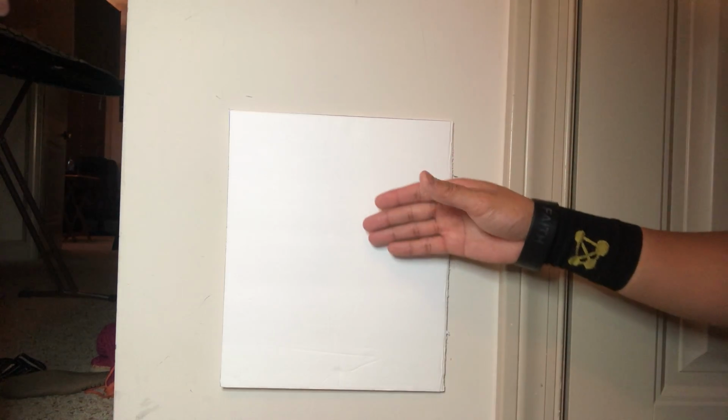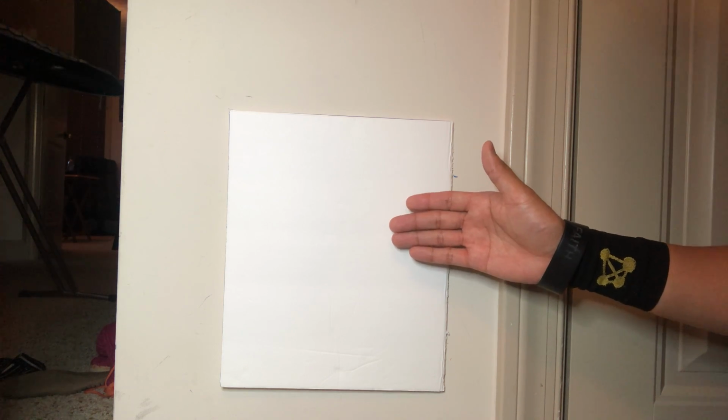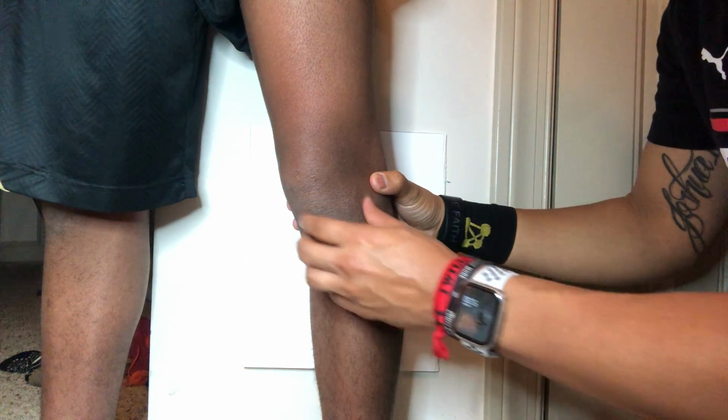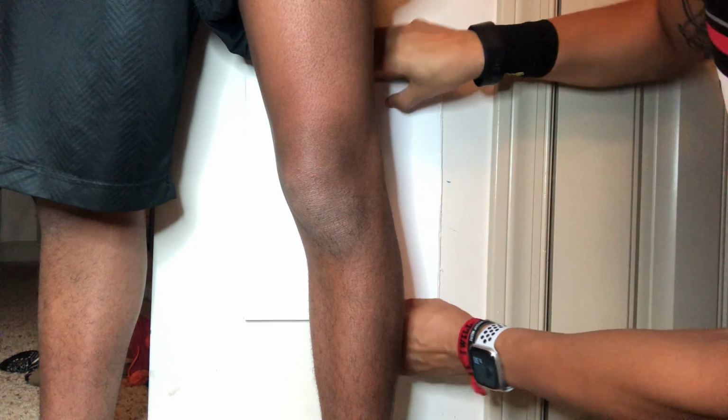So all the projections for the knee are going to be at 40 SID, and we're going to use a 10 by 12 image receptor. I'm going to have my patient bring the knee in. I'm going to move this back. We're going to have them stand and internally rotate the knee about 5 degrees for the AP, for the center.